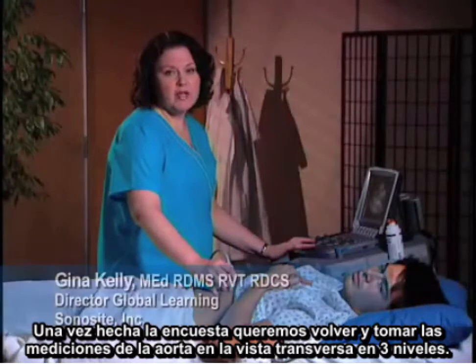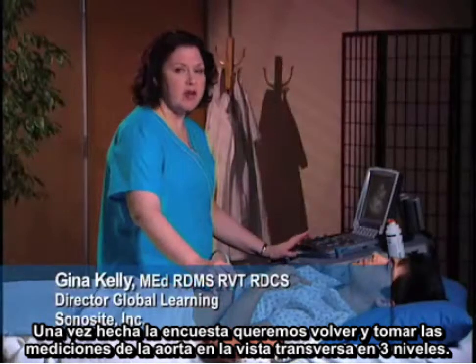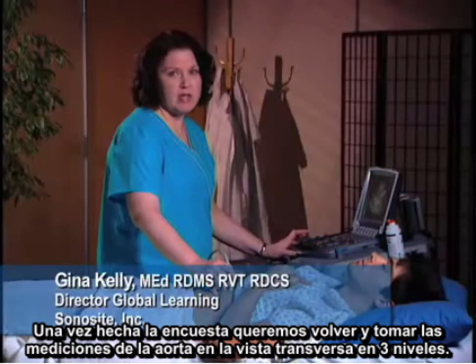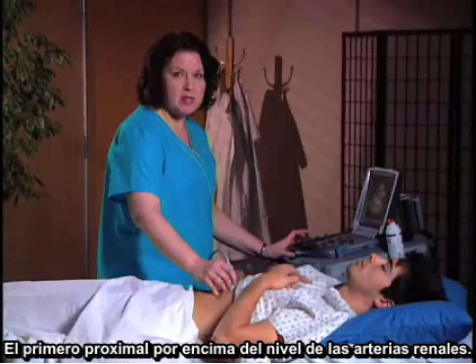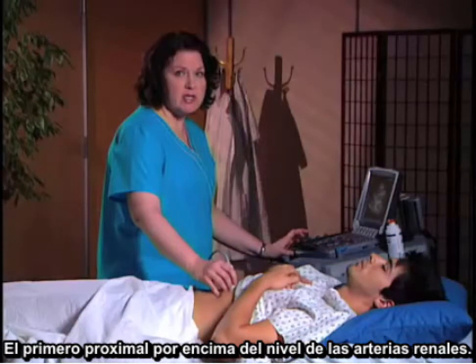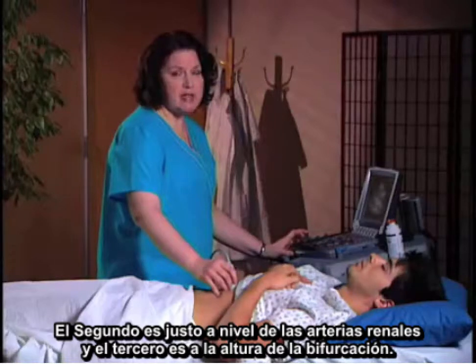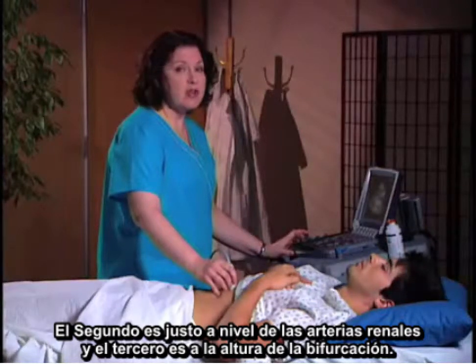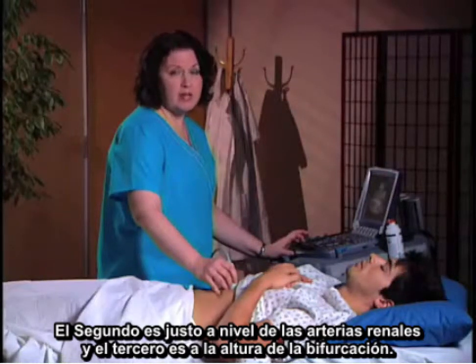Once we've done the survey, we want to go back and take measurements of the aorta in a transverse view in three levels. One level is proximal, above the level of the renal arteries. The second is just at the level of the renal arteries. And the third is at the level of the bifurcation.